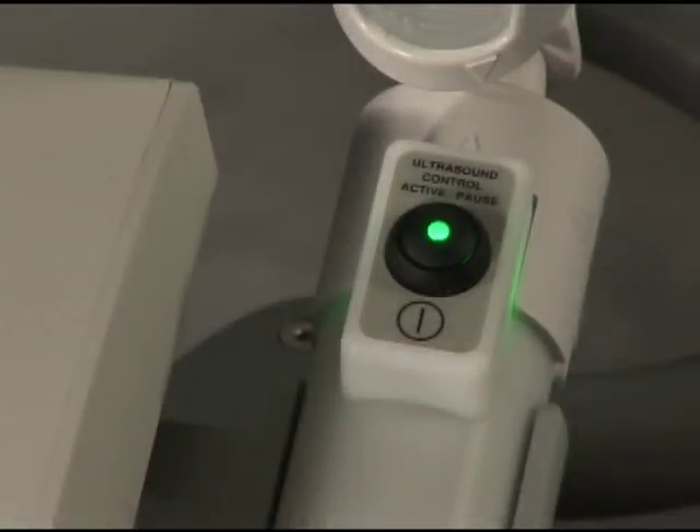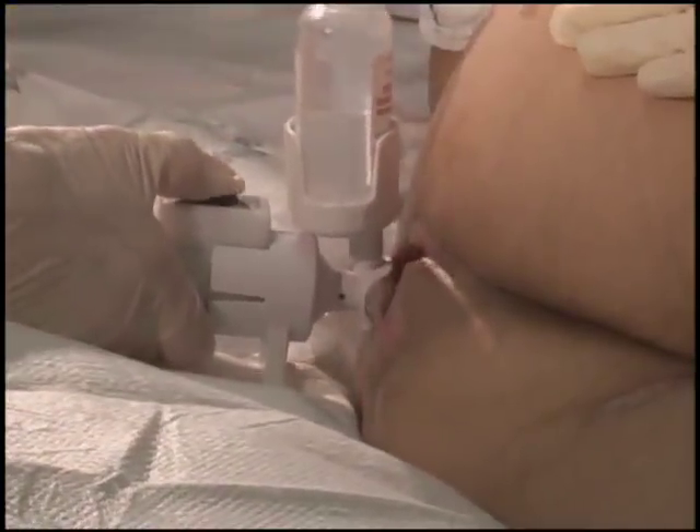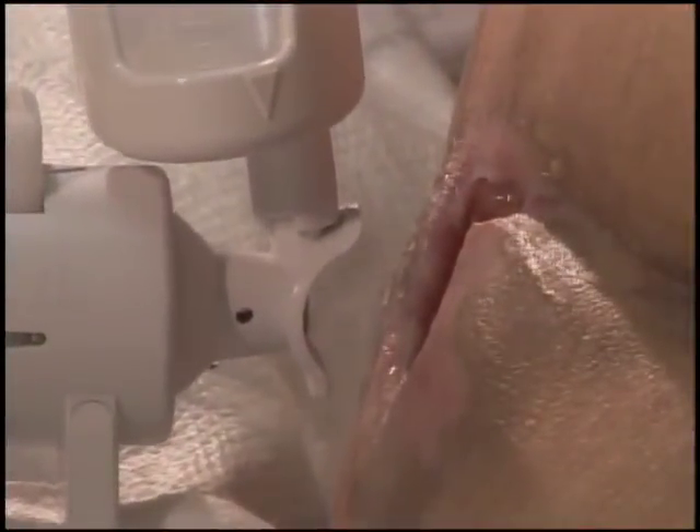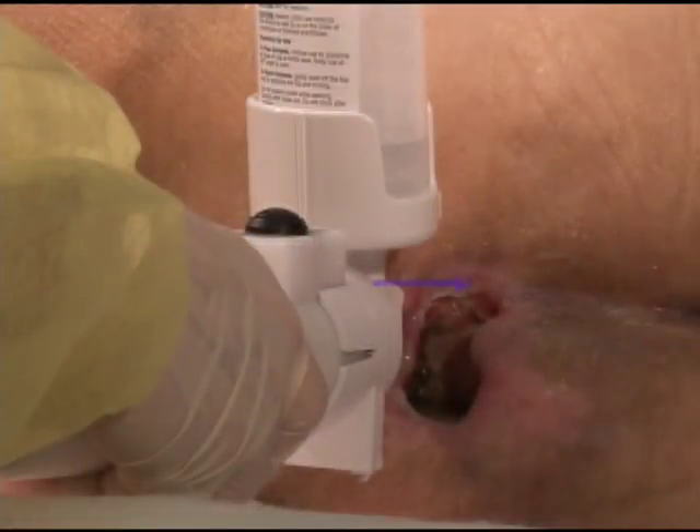The solid green light on the transducer indicates the system is ready for use. Depress and release the control button at the top of the treatment head. The flashing green indicator means ultrasound is being delivered to the wound. Do not hold the button down during the treatment.